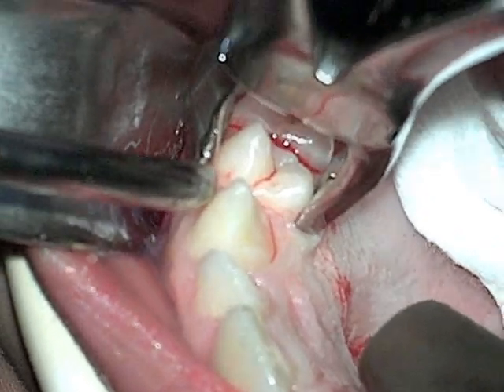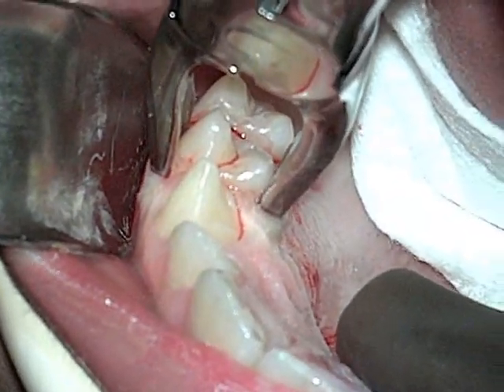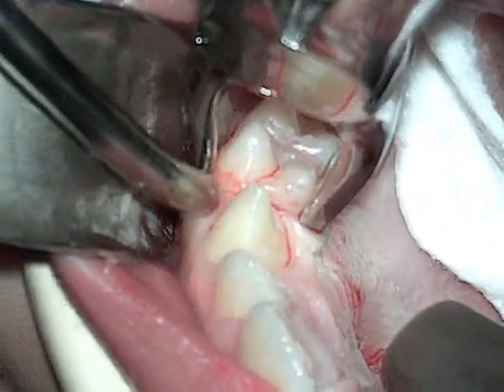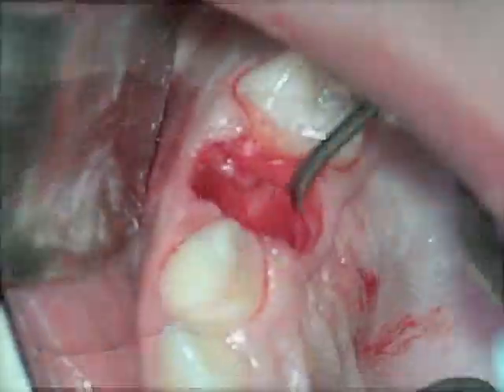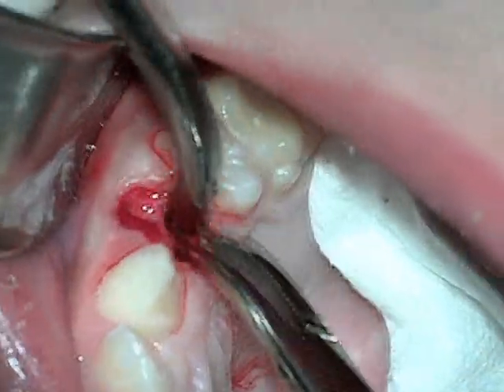And I'm just going to start gently rocking back and forth to the palatal, to the buccal, to the palatal, to the buccal, maybe give a little twisting motion. And what I'm going to do is slowly expand that alveolus and give it a little wiggle again, and slowly expand that alveolus until the tooth just gently lifts out, and then go back with the curette and clean out any debris and any tissue tags that may be there.